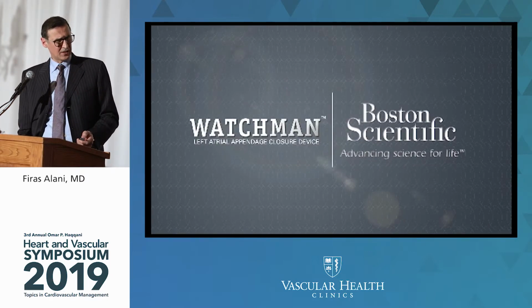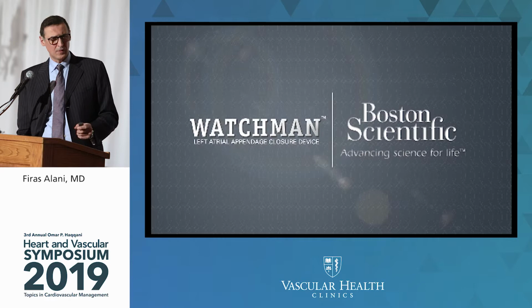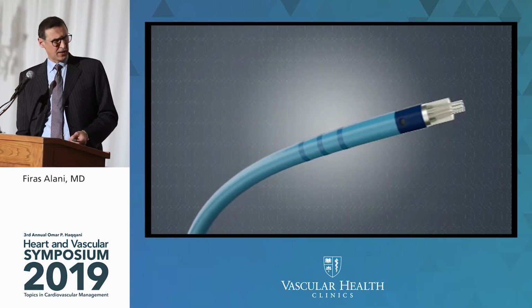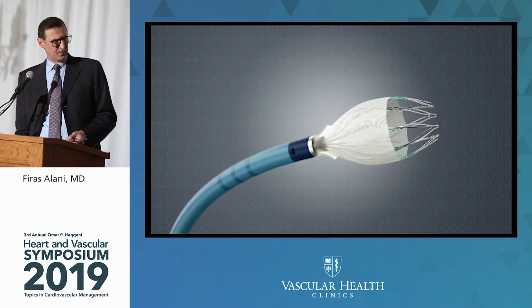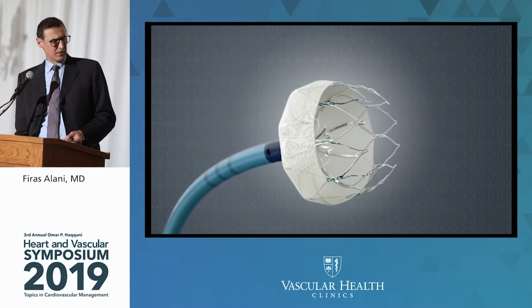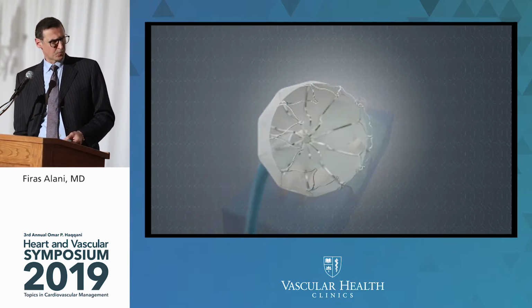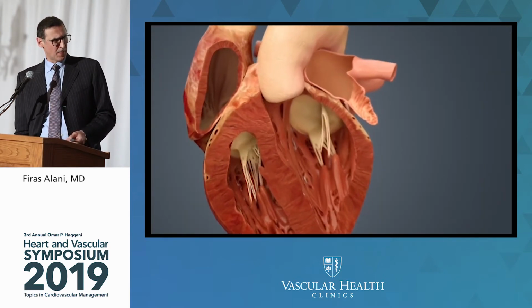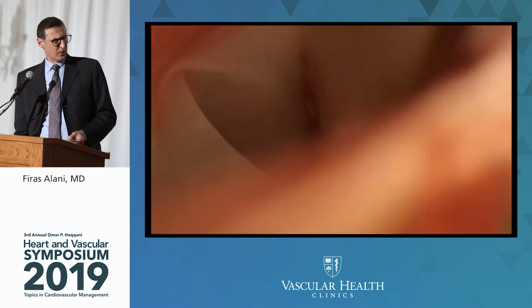You could probably fast forward some of that video. This is a catheter going in. This is what the Watchman looks like when you deploy it. You can just skip forward some of that. It's a long video. Thank you. So here now we're getting there.